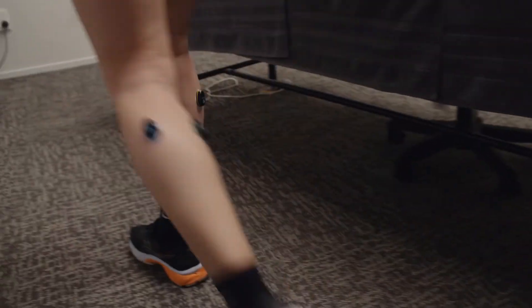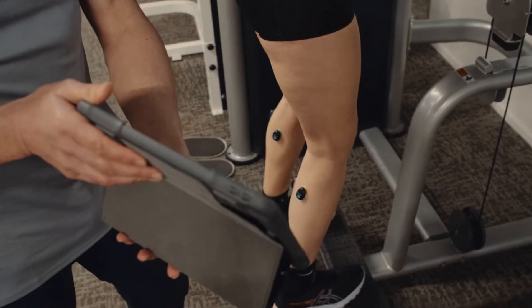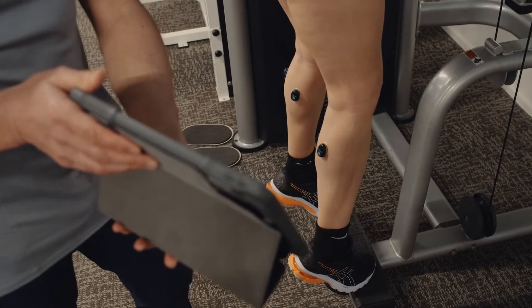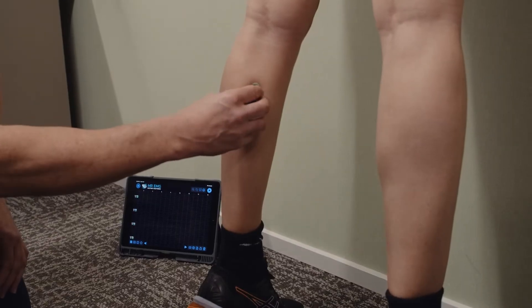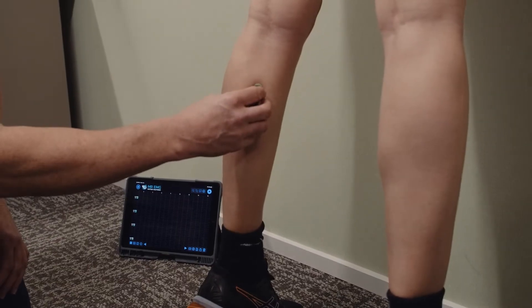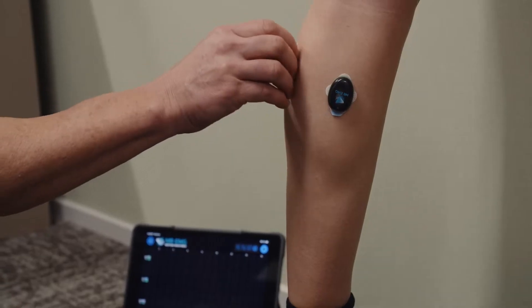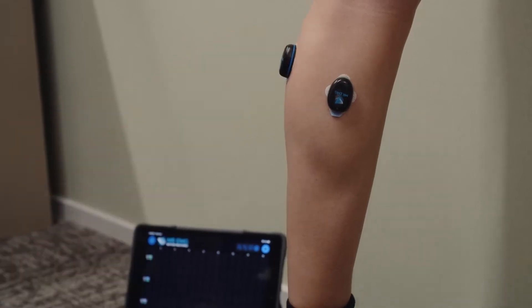In this instance, we will compare both legs, medial and lateral gastrocnemius muscles. The calf muscles tested in an evaluation are entirely up to you, the clinician, and what you would deem most appropriate for your subject.